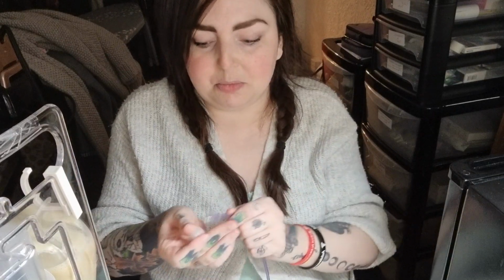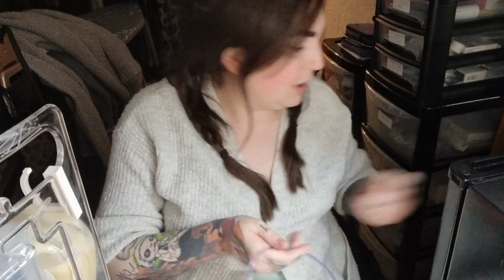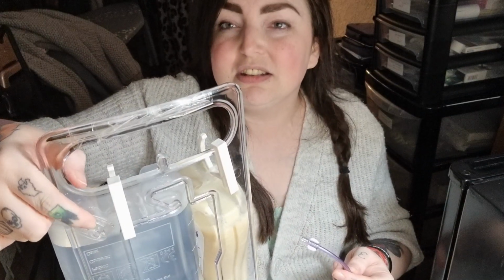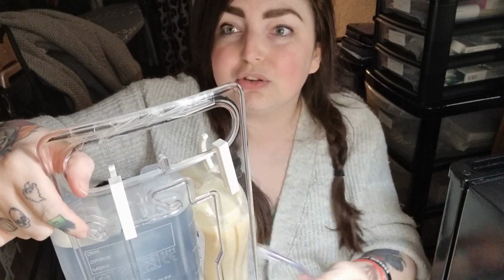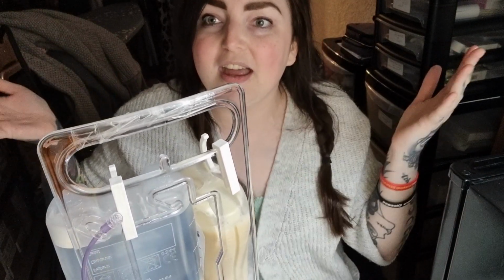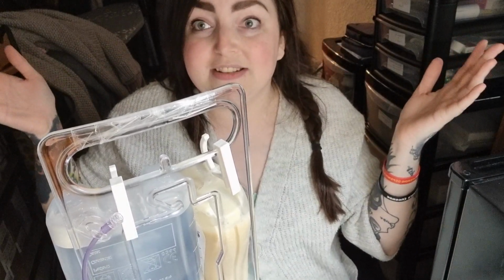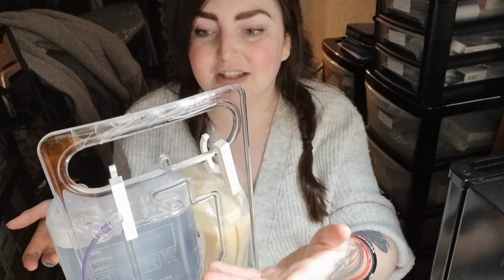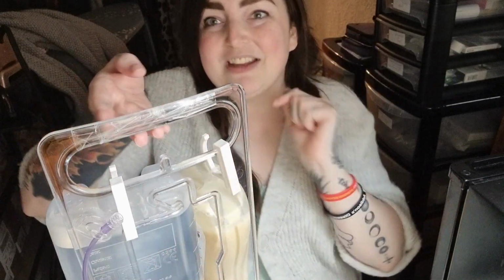Pull that off. You're not going to break this. I thought when I first got it, I thought this would break really easy, so I would be trying to pull it and it was really difficult, but now I just rip it off. You take the end off, and this is where my invention comes in. So you see this little hook. Ta-da! Who needs your mouth or to hang it around your neck or whatever? Ta-da! I'm a genius. I invented that.